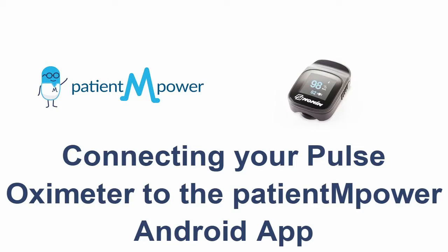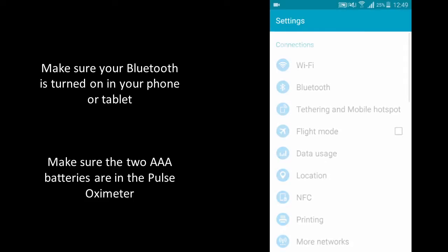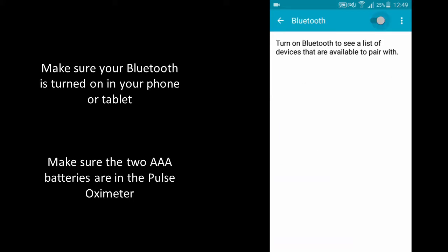In this video we're going to show you how to pair your Nonin Pulse Oximeter to the Patient Empower app. First you need to ensure your Bluetooth is turned on in your phone or tablet. To do this, visit the settings section on your phone or tablet, go to Bluetooth and slide the switch across.